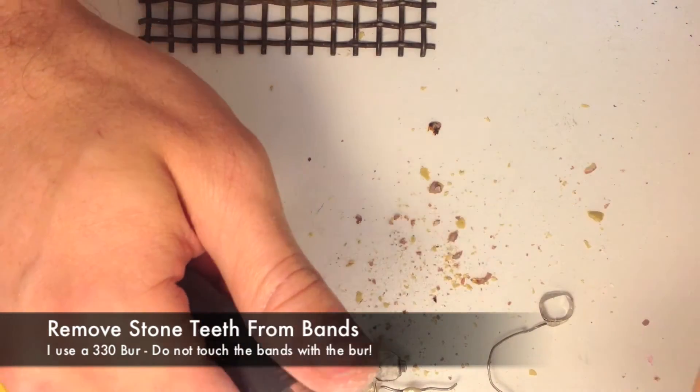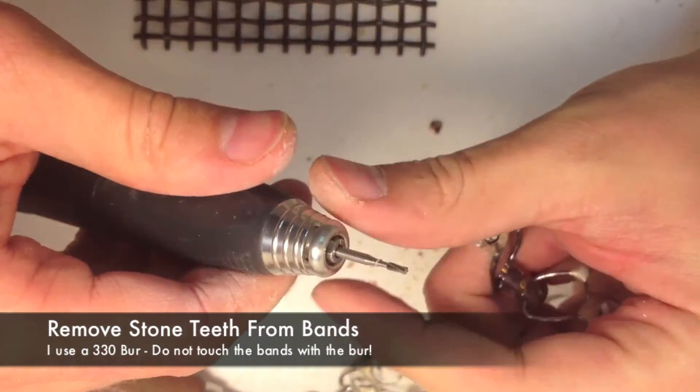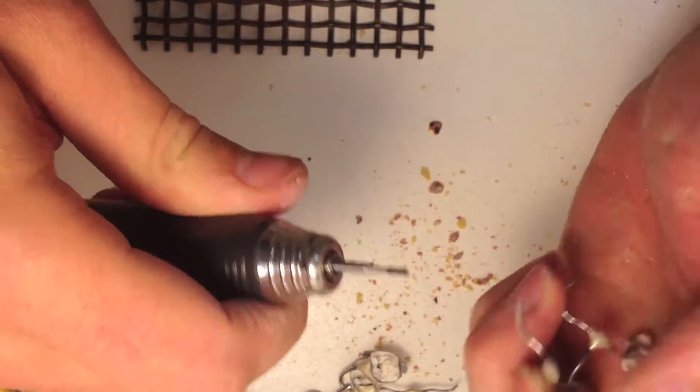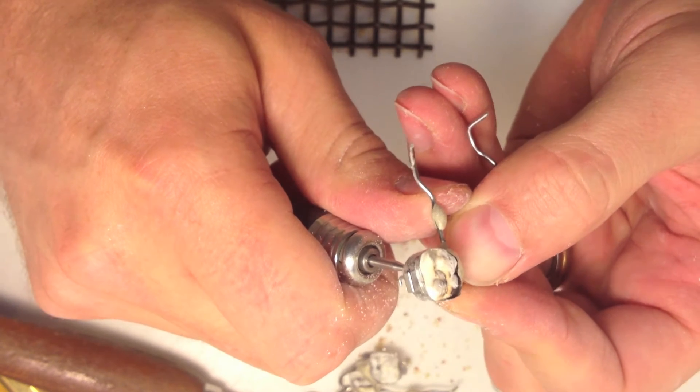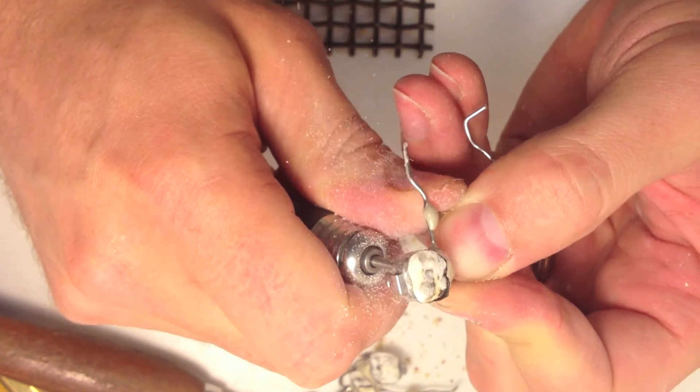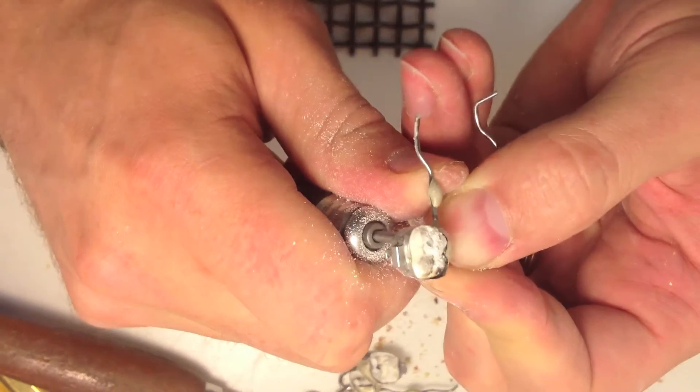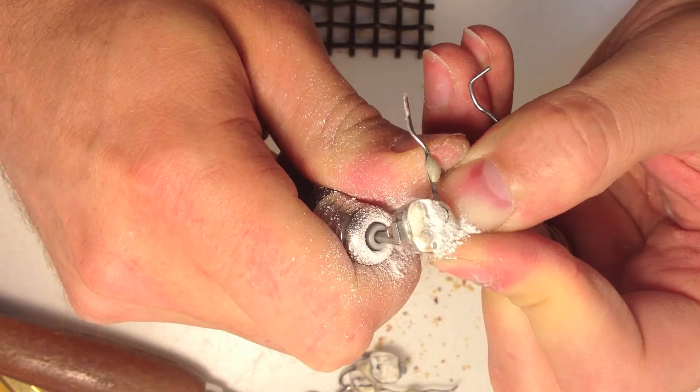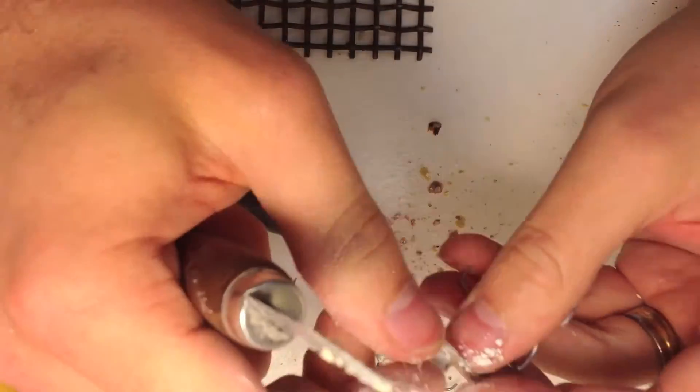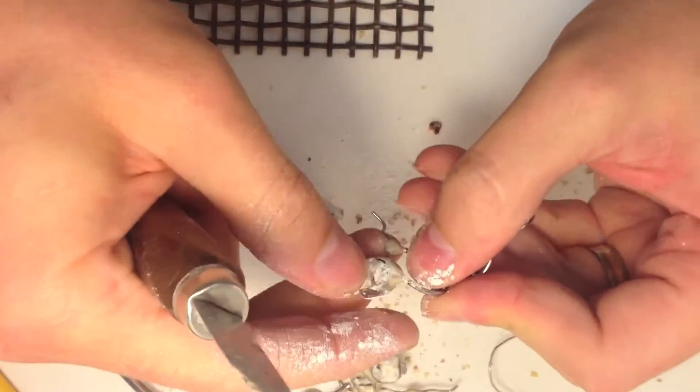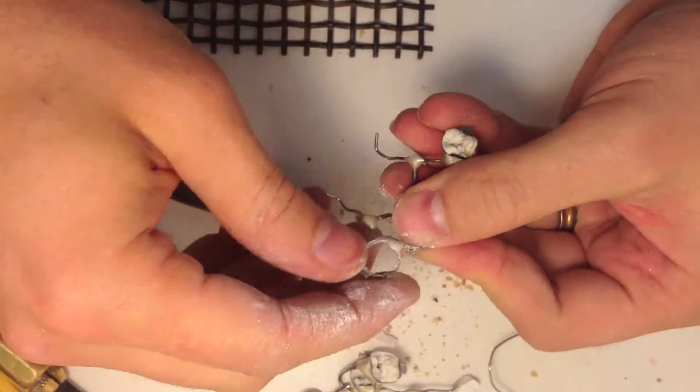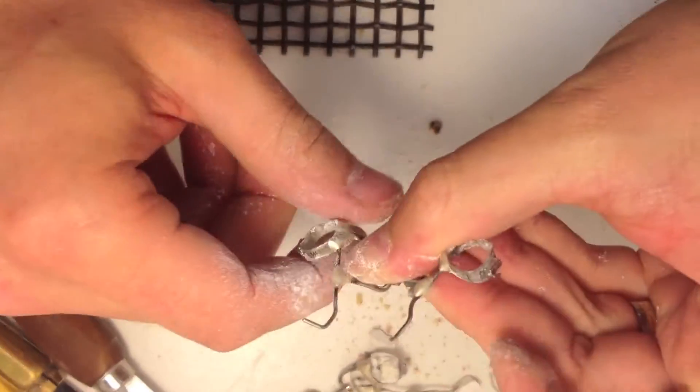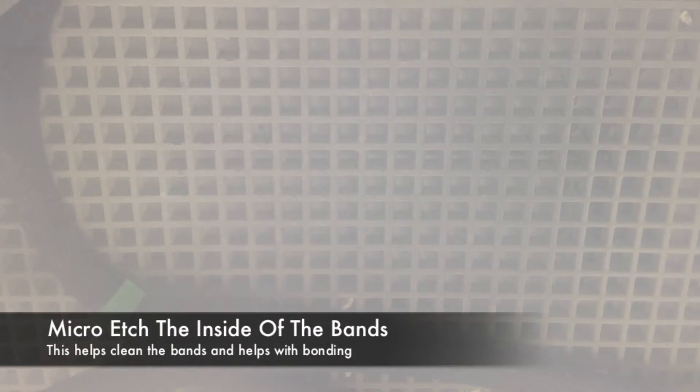Now the fastest way to get the teeth out is I like to use this 330 bur. It's like a little fluted thing. Cut them out. Let's go right to the middle first and then go to the side. Do not go all the way to the side. Do not want to cut your metal band or you will be making a terrible phone call to the doctor saying you need a new impression and a new band. See how that came out, made a slot in there. It should just break free.